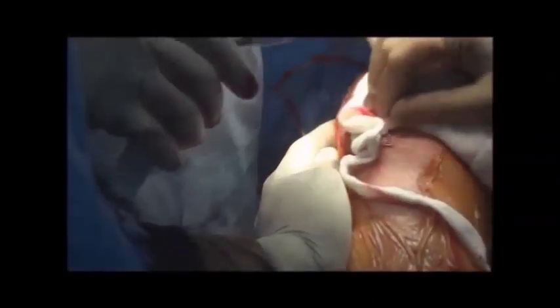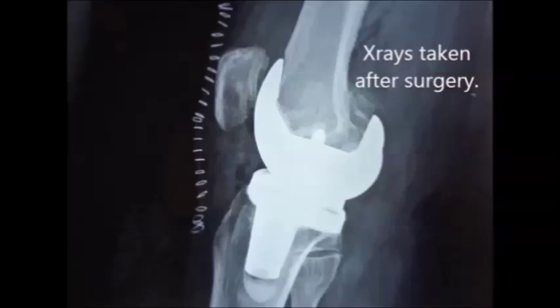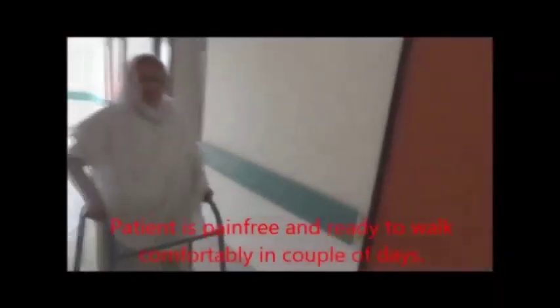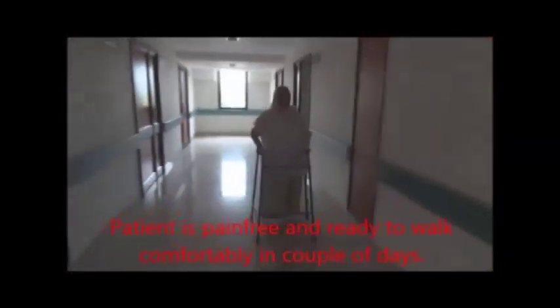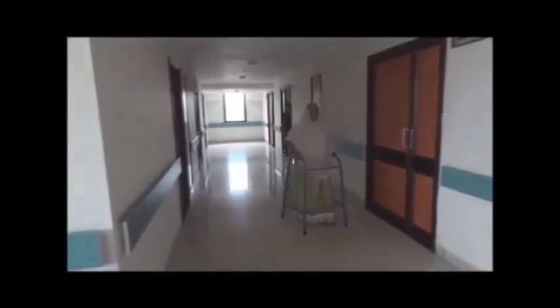The artificial joint usually lasts for 15 years or more, provided meticulous attention is given to the knee joint alignment and the implants are fixed in anatomical position firmly. The total knee replacement surgery is usually performed in those patients who are suffering from extremely intense knee pain, which is hampering their day-to-day life.